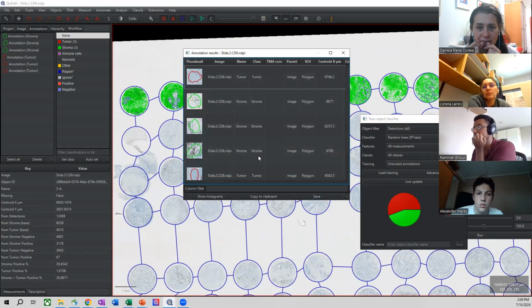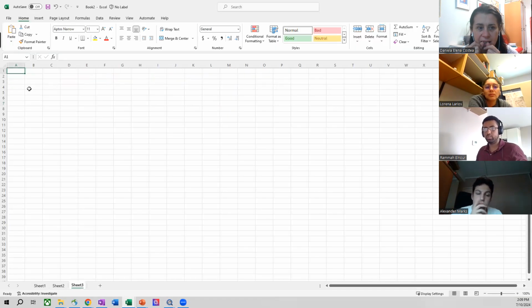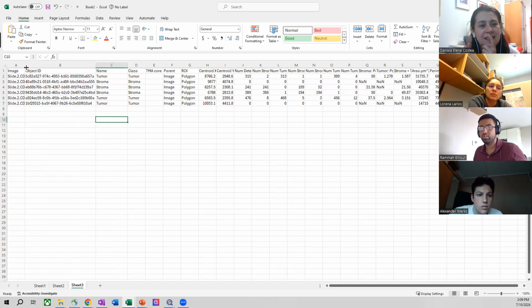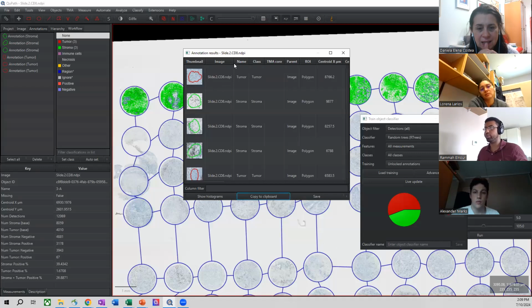I'm just going to try to copy the information. Second. Let's see. Okay. I was hoping that it would be named automatically. It is strange. Okay. But maybe we'll figure it out. Yeah, maybe I can look into that myself as well.